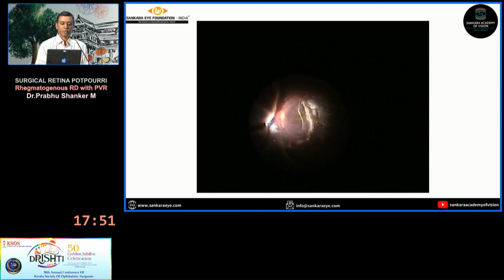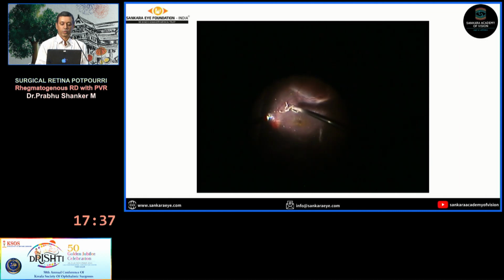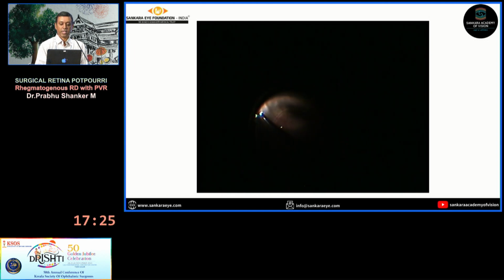So gently lift it up. Once you clear the central core vitreous and the posterior hyaloid, then the retina opens up nicely. So slowly, gently trim. Now inject PFCL, so you push all the subretinal fluid out from the breaks. Then identify all the breaks. Do a very small trimming. This patient had a large tear, a supranasal tear.